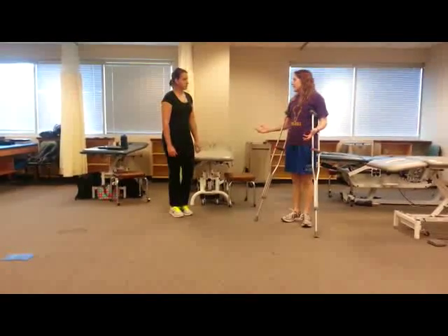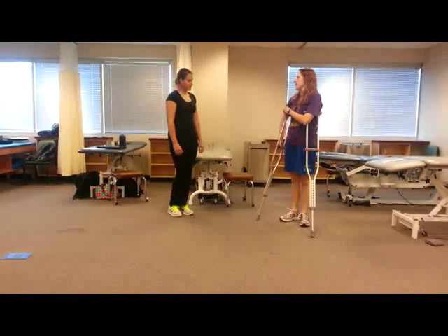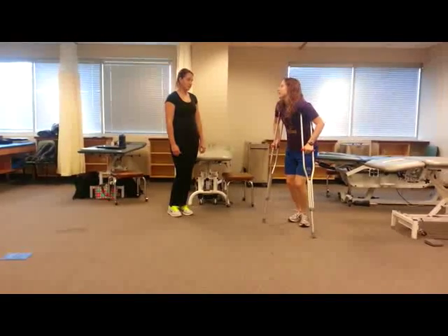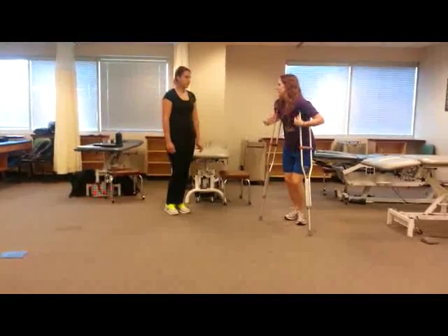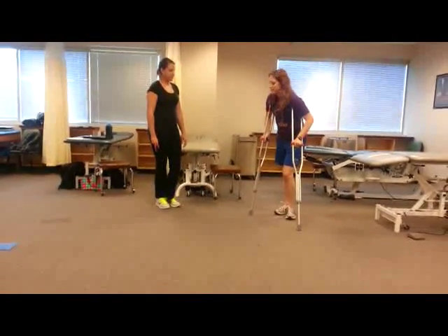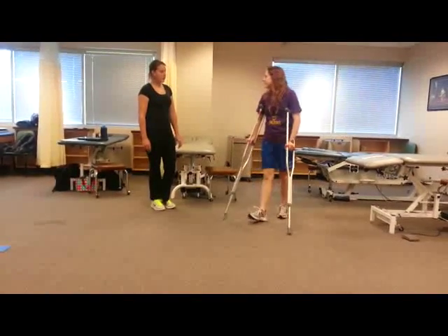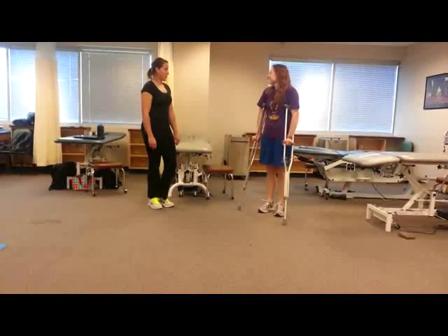Through any of these gait patterns while we're teaching our patient, we just want to make sure that they're not leaning down on their crutches, because you don't want them hurting any vessels or nerves in their armpits. So just make sure you watch your patient and make sure they're not leaning like that. Otherwise, you should be all set. Thank you.